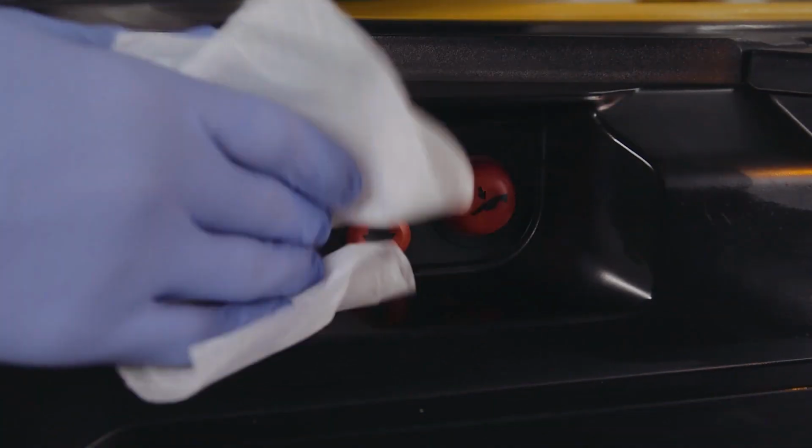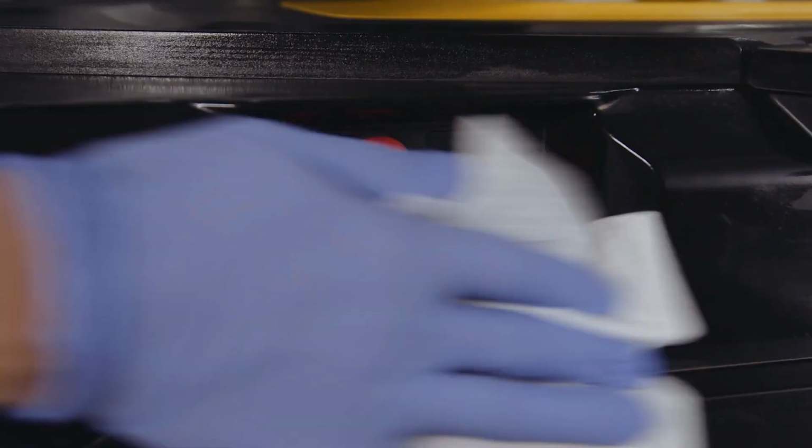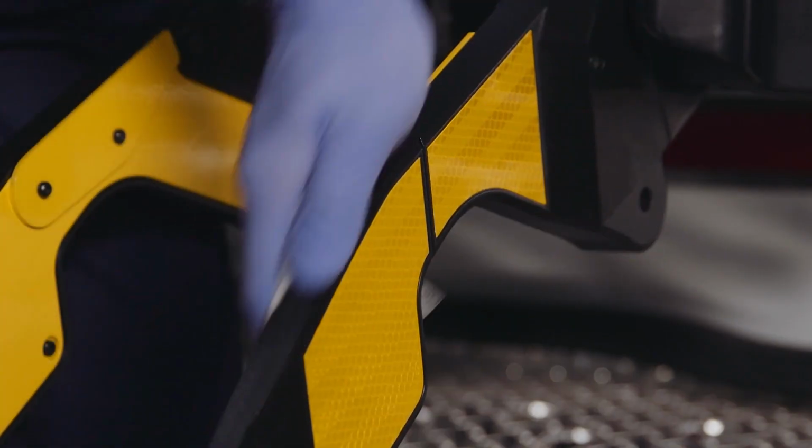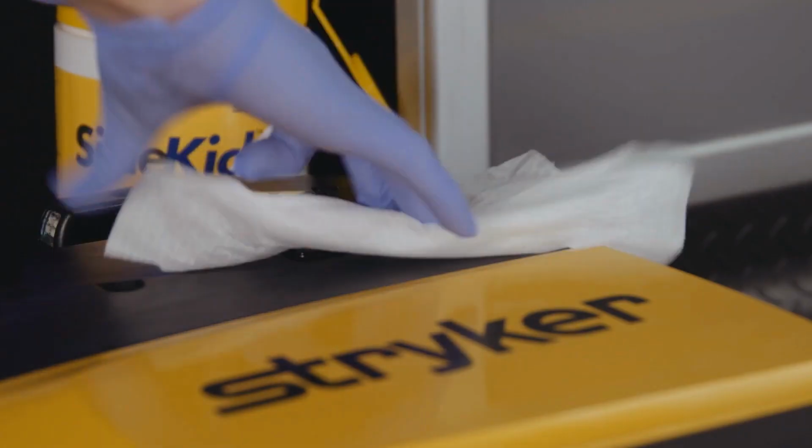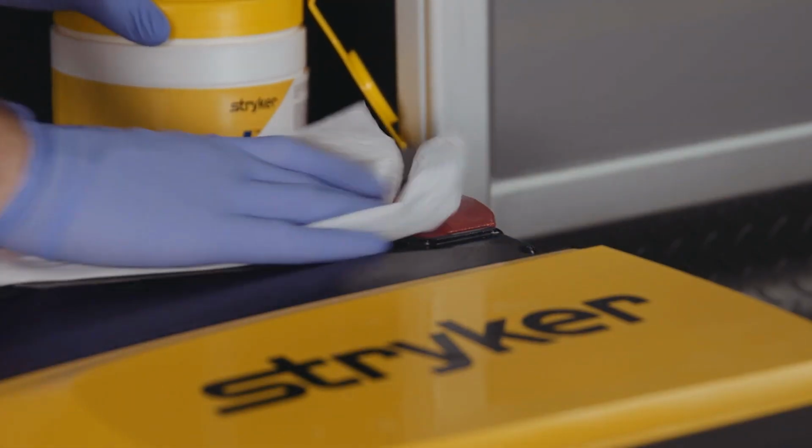The Operations and Maintenance Manual has information that will help you establish a preventative maintenance schedule. You'll also find a series of checklists for operators to use that will help you track preventative maintenance activities. You can adjust the routine maintenance schedule to your actual service usage.